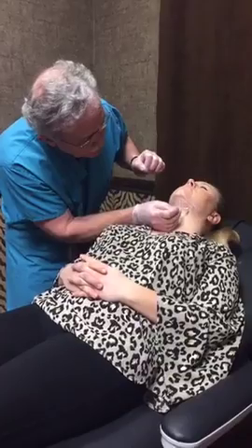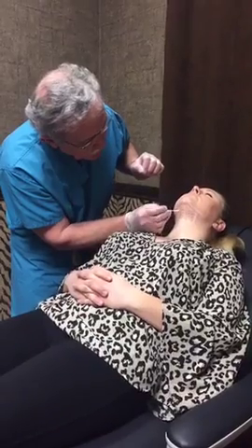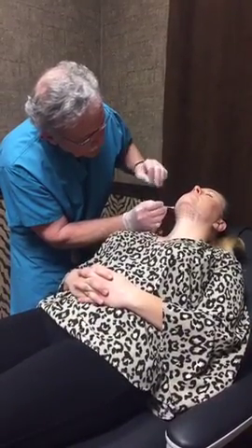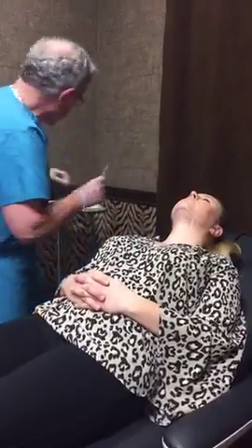So we have 1, 2, 3, 4, 5, 10, 15, 20, 25, 32. So we have 32 sites that we're going to inject.